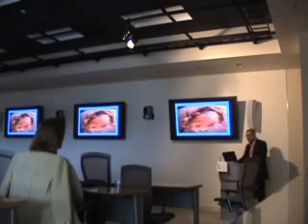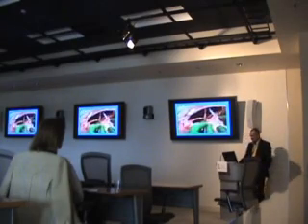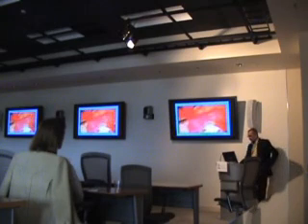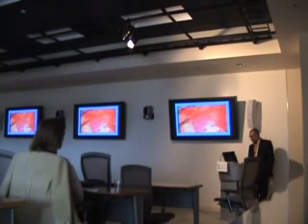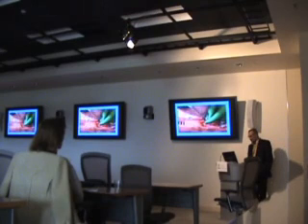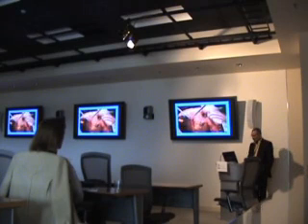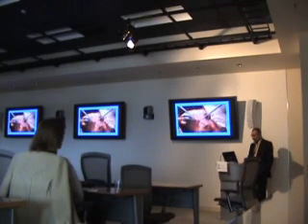Can you believe that? A beating heart in a cadaver in preparation of coronary bypass. This is the mammary artery, bleeding from the mammary artery, and practicing beating heart surgery in the same anatomy of the human being.